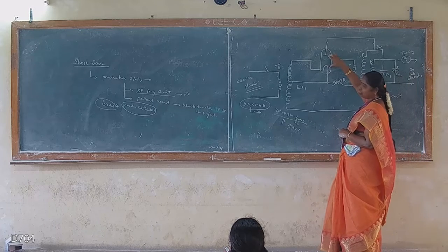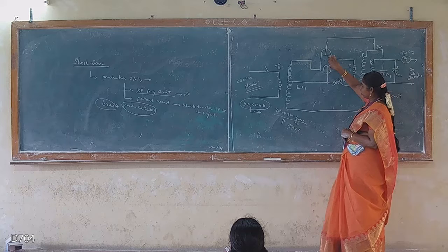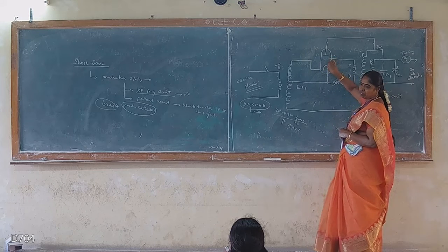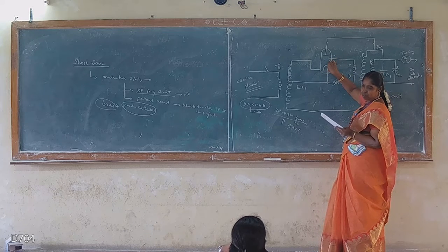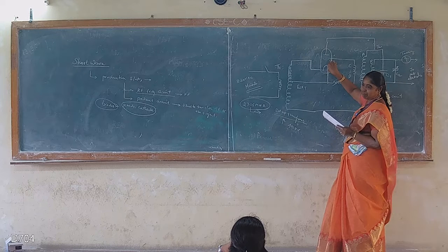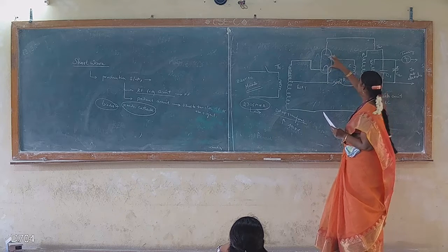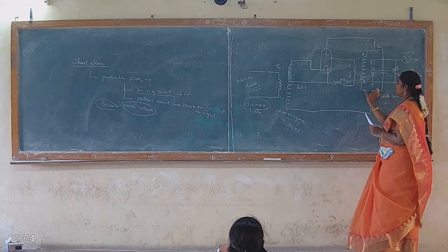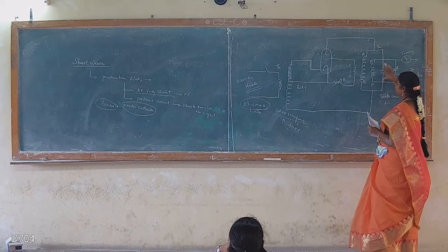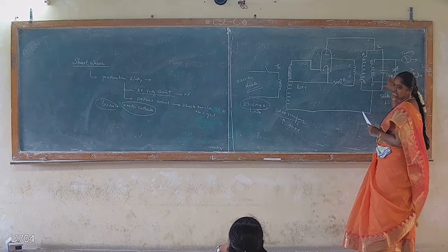Because the anode and cathode are connected with a high amount of voltage, the electrons can move because of the drift operation. That particular voltage is now captured and used for these LC circuits.